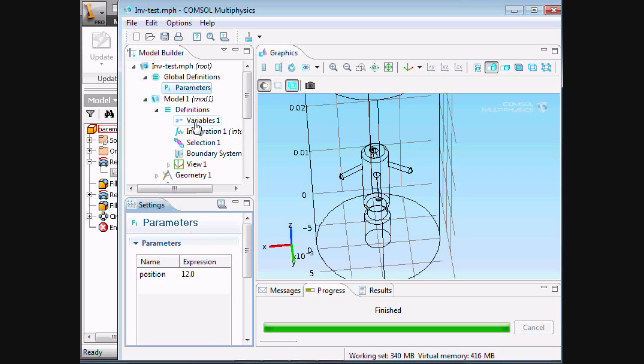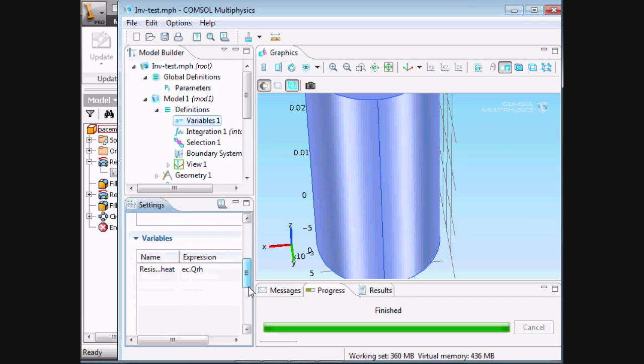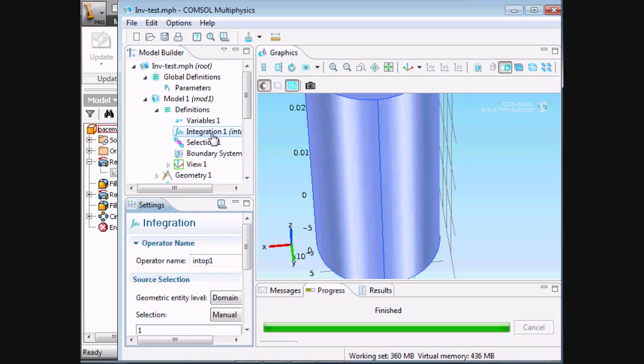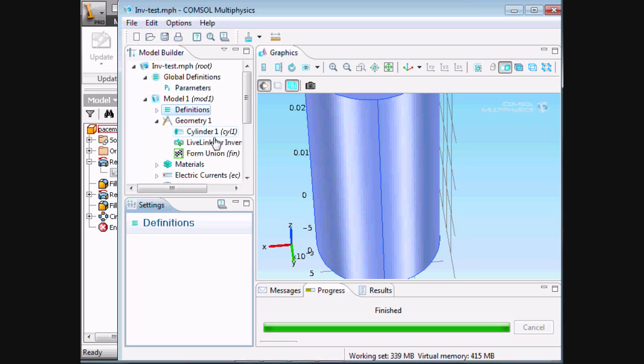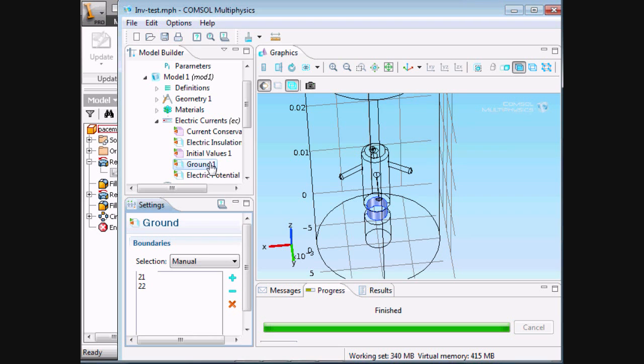We've added definitions of what we would like to calculate from here, including the resistive heat, and then we want to do an integration on that to get the total resistive heat. We've added a cylinder to the geometry, so even though only one is the LiveLink, we can still add extra geometry to it. We've added materials, the electric current values, including the initial value at the very top of the electrode, and the ground values.